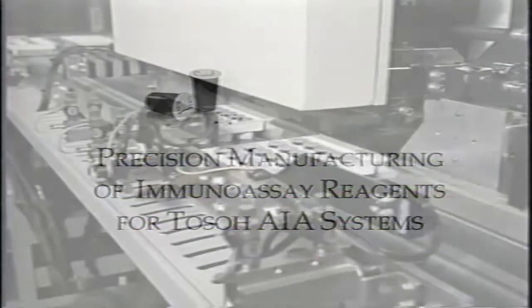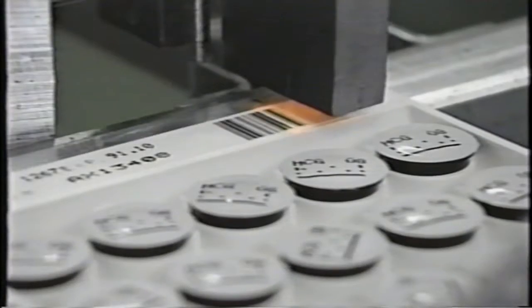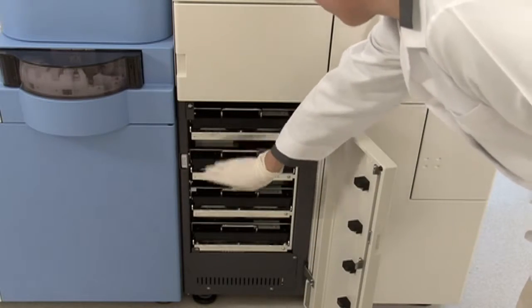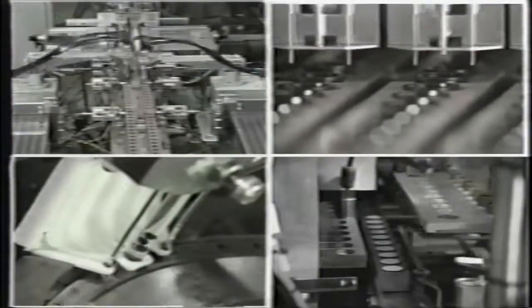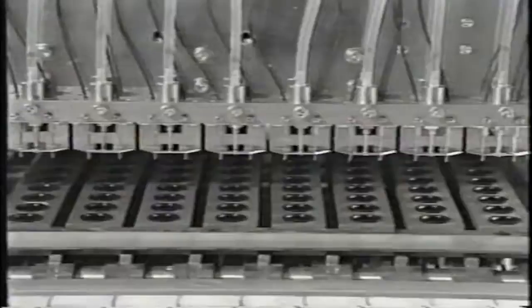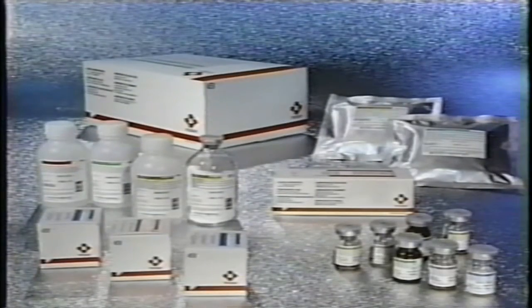Accurate and precise immunoassay results begin with quality reagents. We will take you through TOSO's state-of-the-art facility, dedicated solely to the manufacturing of reagents for our TOSO AIA systems. In a completely automated facility, incorporating the latest advances in robotics and quality control techniques, the AIA-packed test cups and other reagents for the AIA systems are meticulously manufactured and stringently tested. There is one single objective: to maintain performance and improve productivity in your laboratory by providing you with the highest quality reagents.